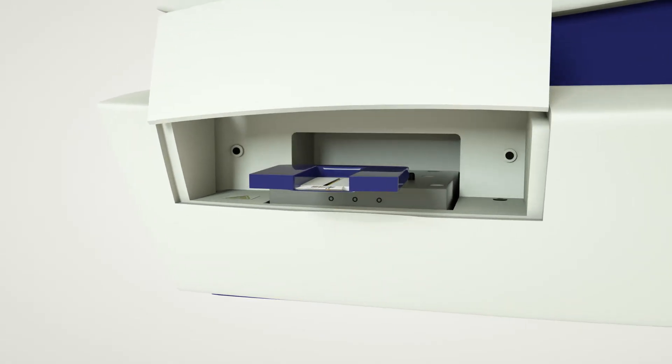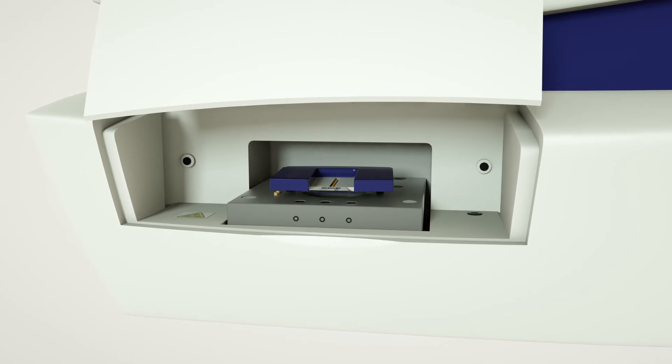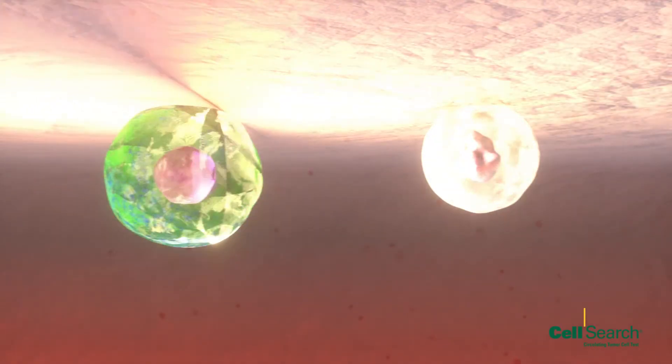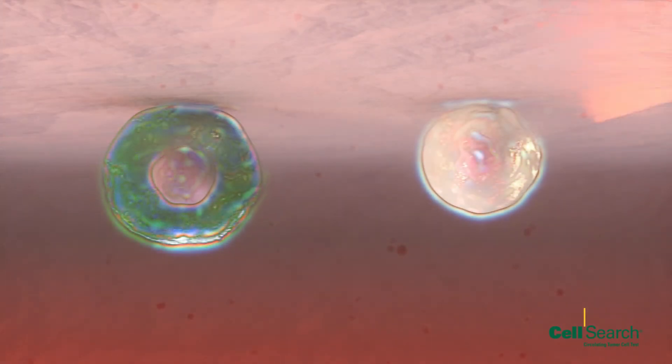The magnet is then inserted into the CellTracks Analyzer II. The cells, which are now held in place at a single focal depth, are automatically scanned by the fluorescent optical system of the CellTracks Analyzer II.